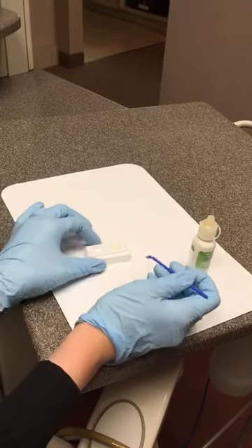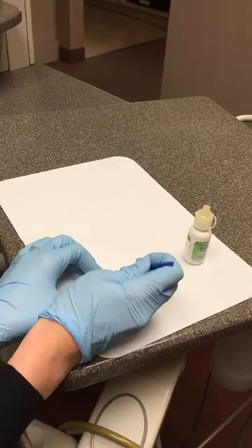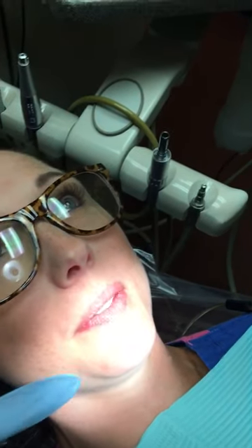I'm just going to bend the tip of the brush. Then on our patient, I'm going to have her close and swallow first. You can also suction before to remove any pooled saliva.